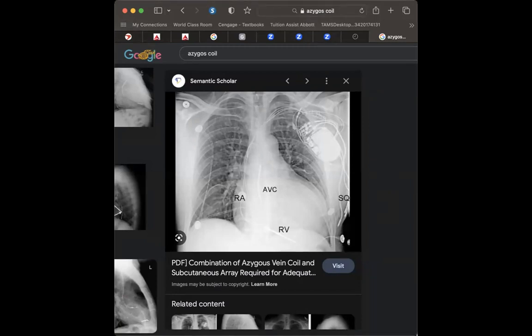Okay. Wow. Now, this aspect is well taken care of, but again, as an interventional cardiologist, you're probably looking at dual chamber ICDs in large hearts and assuming that they'll play their part before taking the route for the coil, because sometimes you have this option of putting in a dual coil ICD lead, the one which is there in the azygos and the other in the RV. So as people who can, the first option is always going to be what you can do endocardially, and perhaps go into a more invasive approach if time and the other things permit.